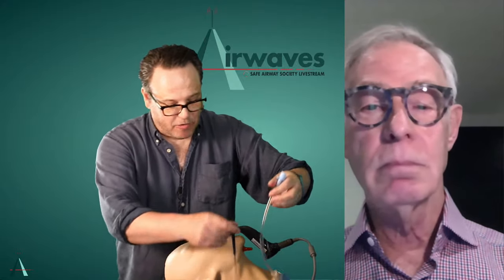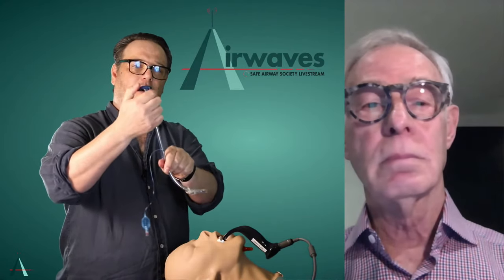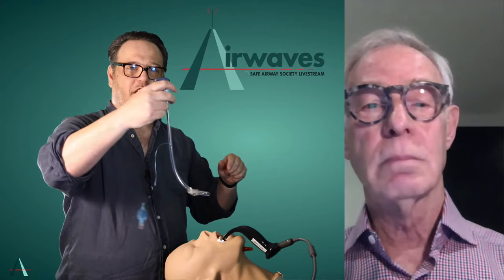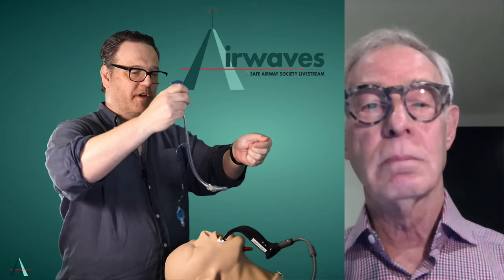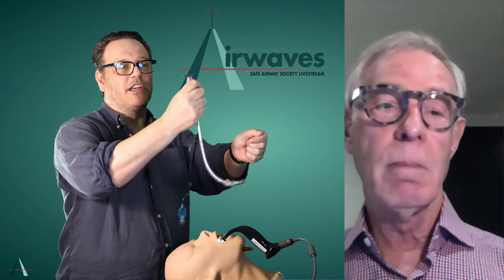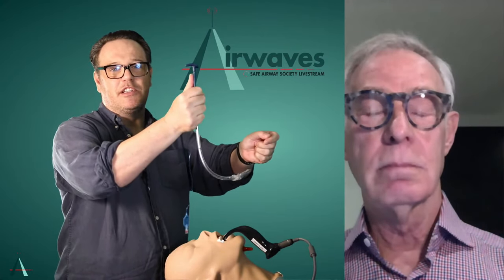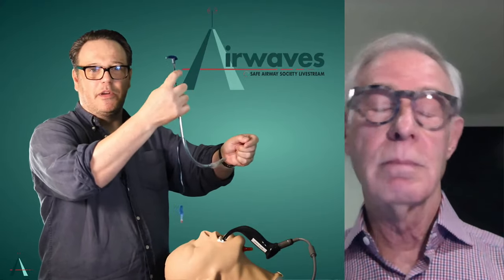Another thing that's probably worth getting your thoughts on that we probably weren't explicit about is how to hold this. A lot of people, the way we usually hold a tube with direct laryngoscopy is sort of halfway down. But I've been holding it at the top. With all the maneuvers we've done, and doing the Cooper maneuver, it seems to be much easier to control it and deliver it. It also gives you the opportunity, with one hand, without moving your hand and potentially dislodging the tip of the tube, to withdraw the stylet as well. Is that how you would hold it, Richard? That's how I do it, but I've never systematically studied the different techniques as far as holding the device.